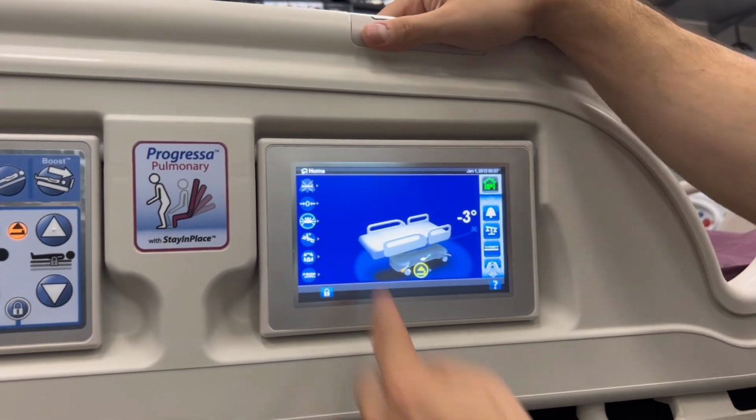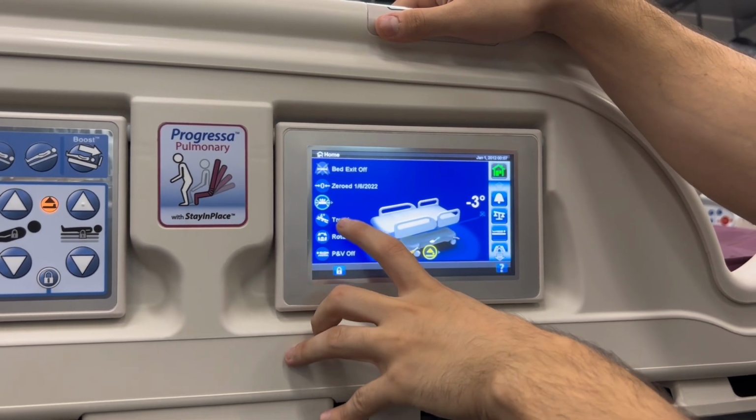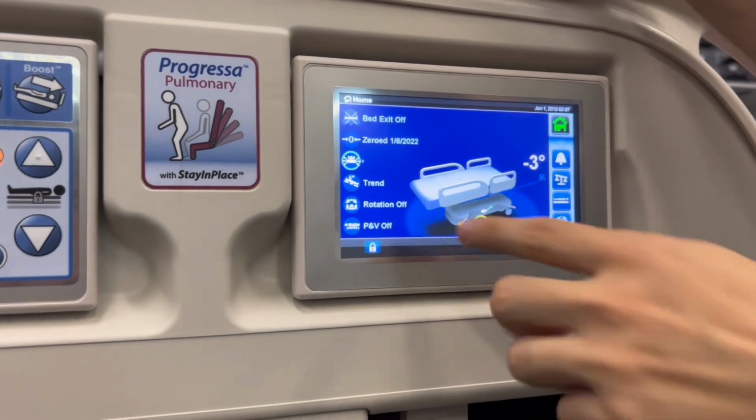So here on the left side, it's going to be our general stuff. That's going to tell us how the bed's condition is now. So we are in Trendelenburg. We don't have any rotation. Our percussion and vibration therapy are off. So that's going to tell us current conditions.